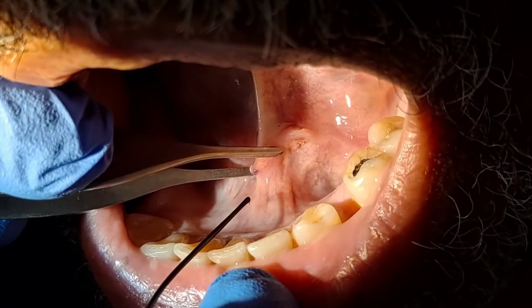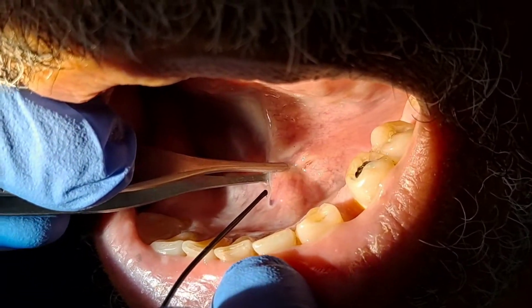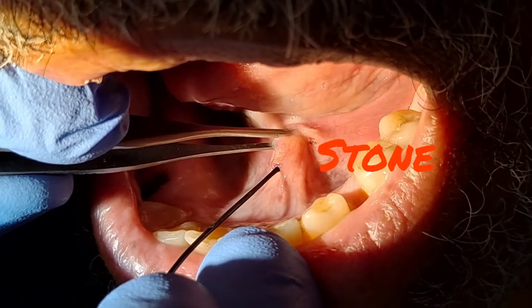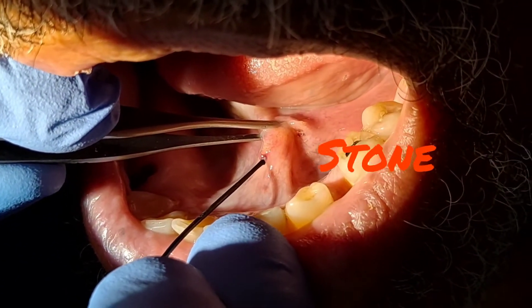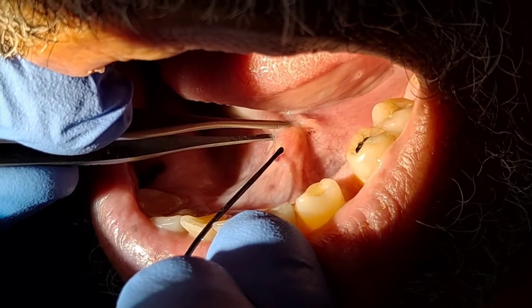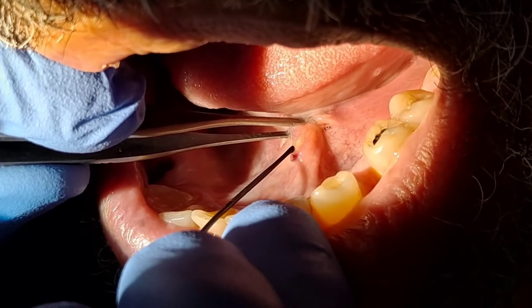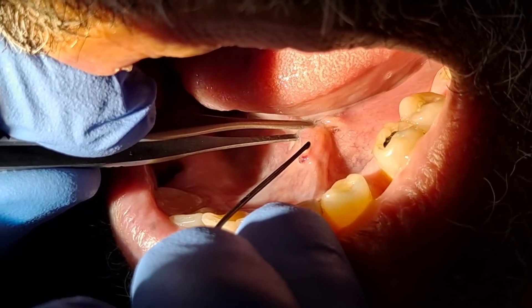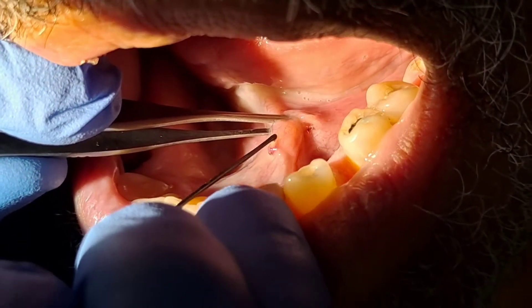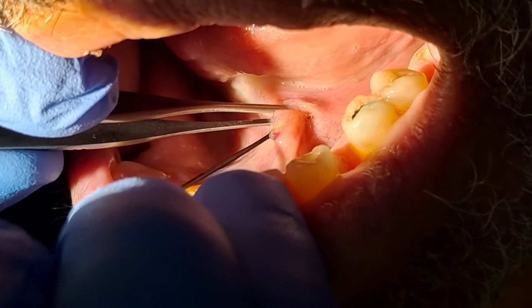Therefore, we decided to make an incision right over the stone in order to extract it. This is the lacrimal probe touching the stone right here — it's a very small one, about a three-millimeter stone.